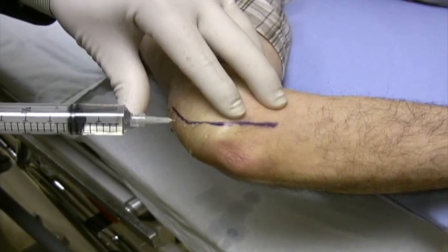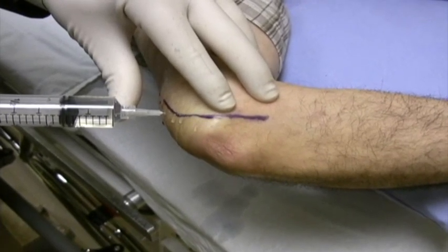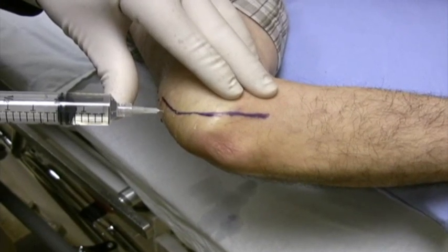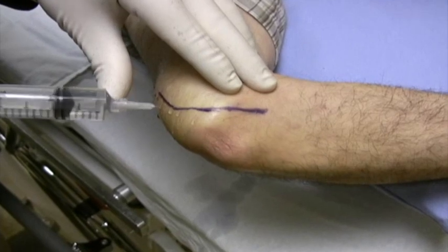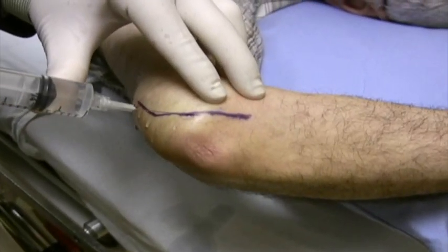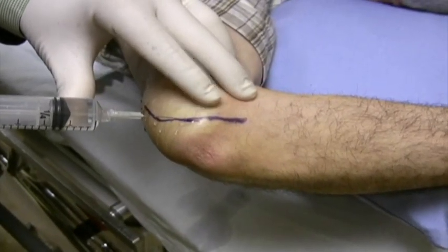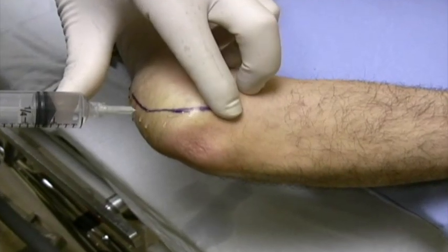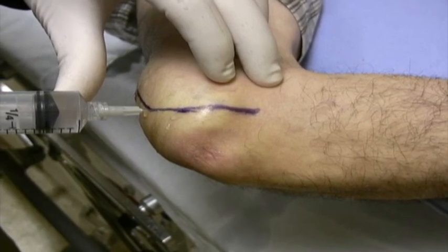Did you feel that? No, good. I was just going just a tad fast there, and I might have got the needle a little close to the white edge of the inflated local. I think you can pretty well see where I am. Always have at least 5 or 6 millimeters of local anesthesia ahead of the needle. Did you feel that? No. Good.